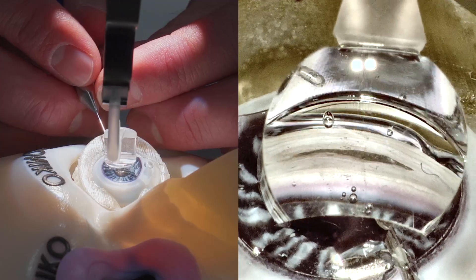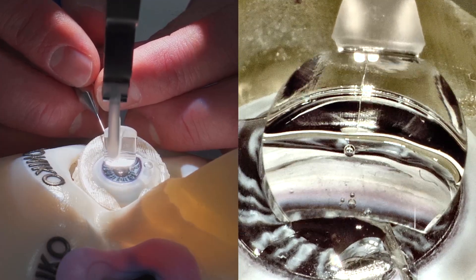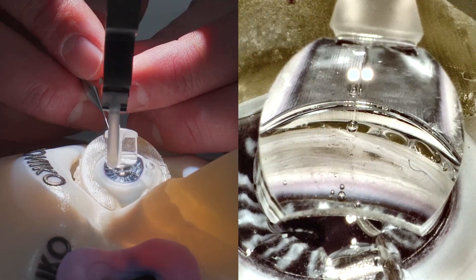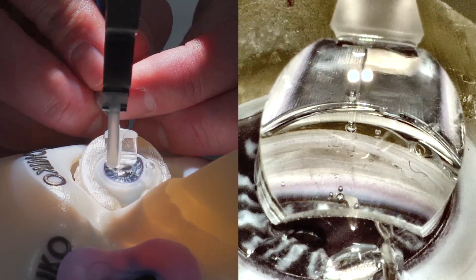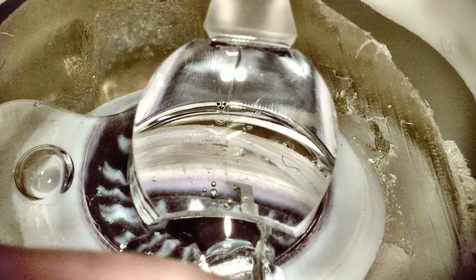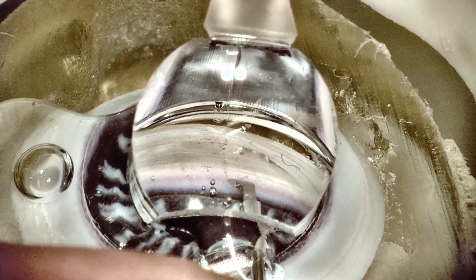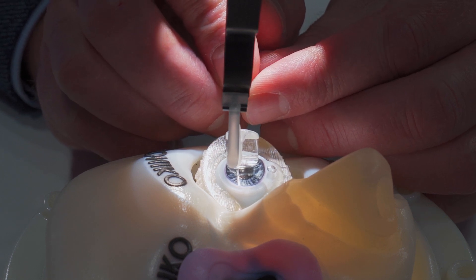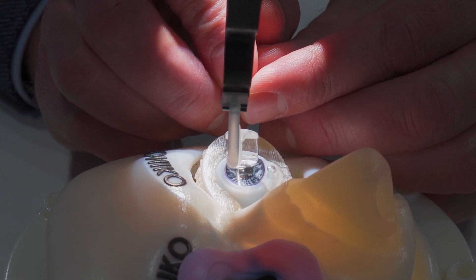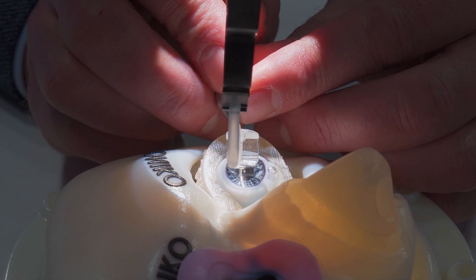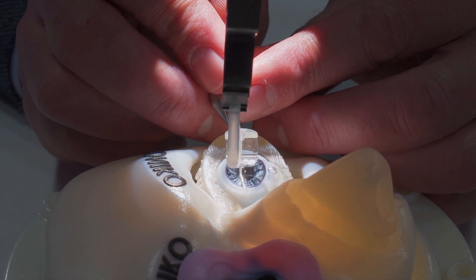It's all with the foot pedal the rest of the way here. Make sure we have as good a focus as possible. See our KDB here. I'm not using my hands at all—both hands are on the device. Both hands are on the KDB glide. I don't care as experienced as you think you may be; having a second hand here to further stabilize the eye is really a nice feature with this hands-free device.